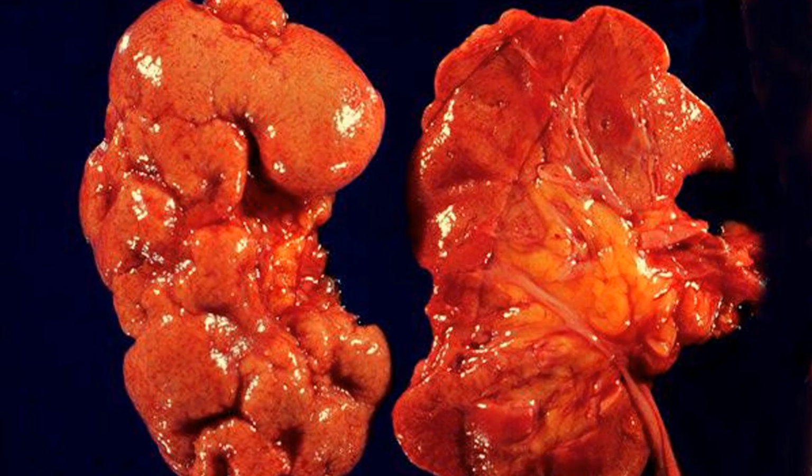Next one is chronic pyelonephritis. Because it's a chronic process, some healing would occur. That's the reason why you can observe that the kidney is shrunken a bit.